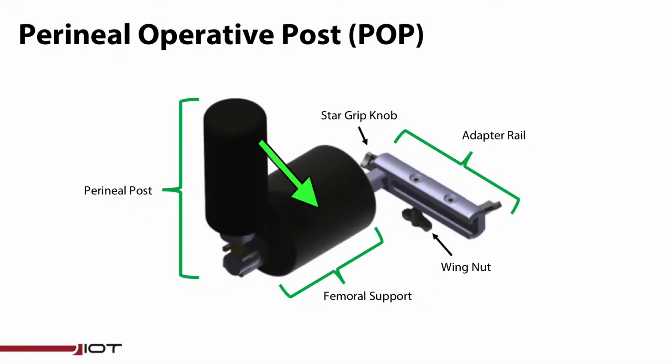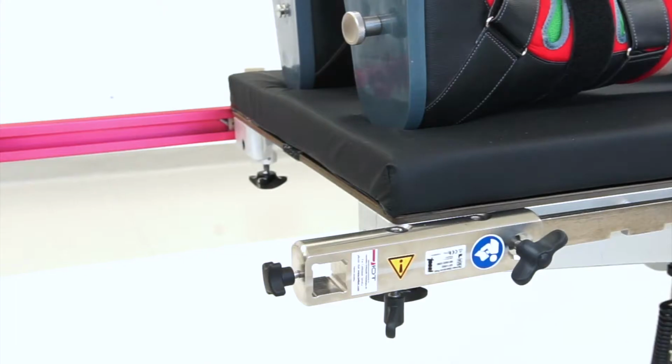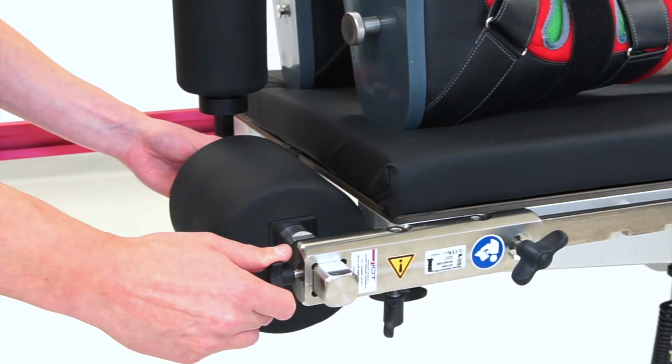Wrap the POP and femoral support pads with Coban, web roll, or plastic before the case. Replace each of these pads after 10 cases. IoT offers disposable plastic POP covers to protect both pads. Tape stickers and a drawstring secure the cover in place. Slide the perineal post with femoral support into the adapter rail and tighten the star grip knob.